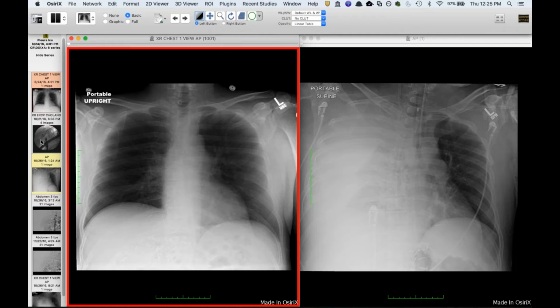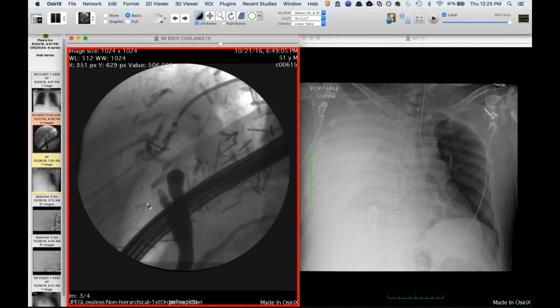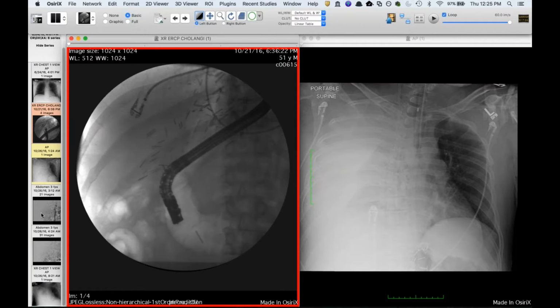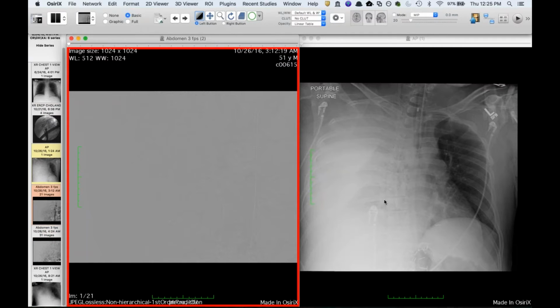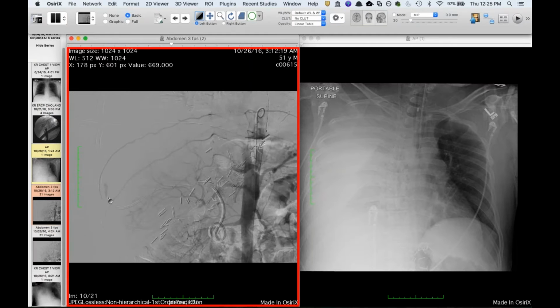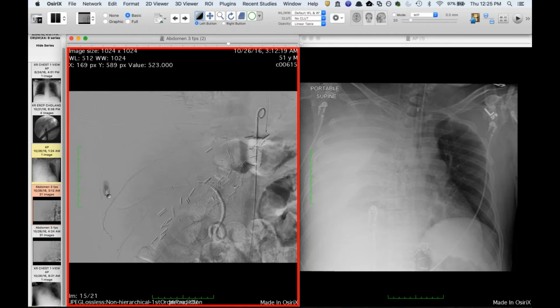And it turned out that a couple hours before this study, he had a percutaneous transhepatic biliary drain placed, which you see here. And so they went back in and did an angiogram, and here, sure enough, you can see that they nicked an intercostal artery from the drainage tube placement. And so that was the cause of his hemothorax. So this was a few hours later in the morning, a couple days ago. But I think it's a nice image of the active extravasation from the intercostal artery.